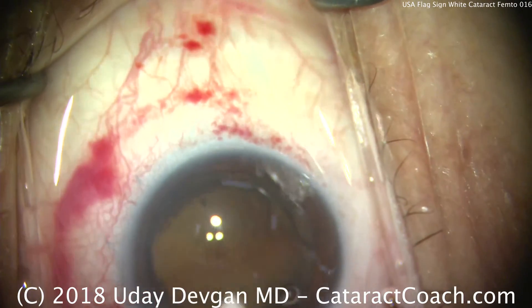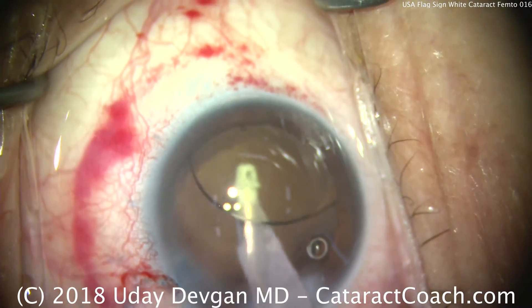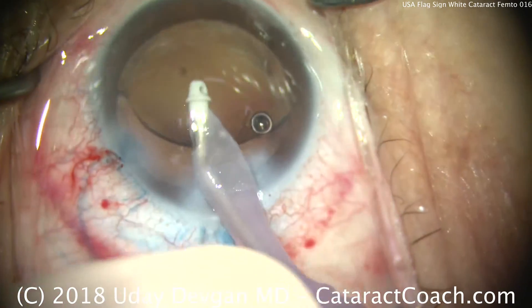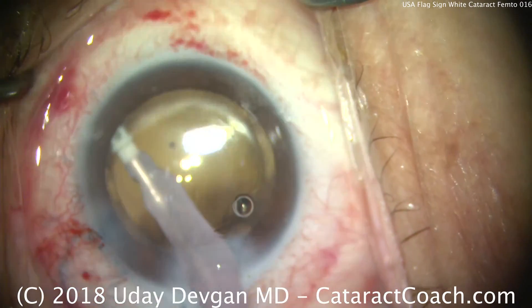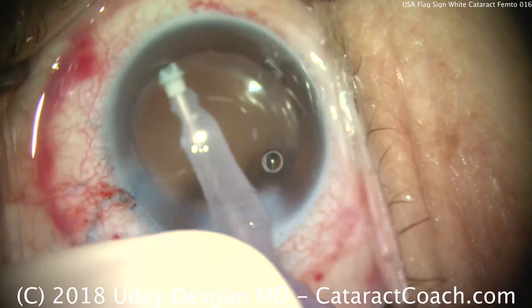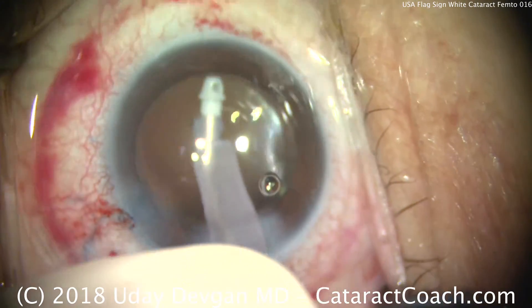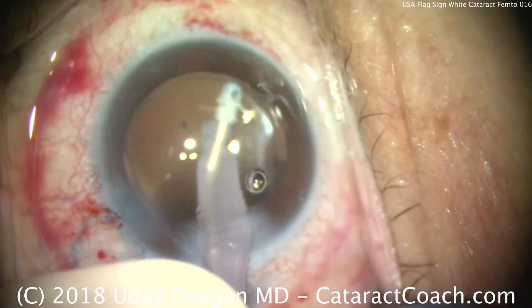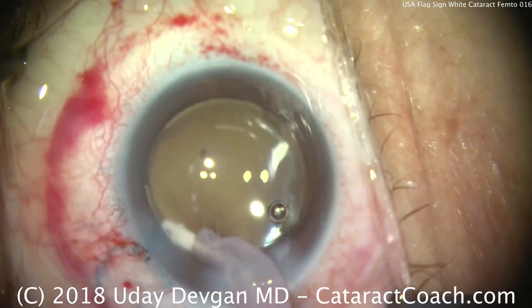We'll go inside the eye and remove the viscoelastic, including from behind the lens as well as from the anterior chamber. This lady has dilated beautifully, so we can see that there's no retained lens material. If you have a white cataract patient with a smaller pupil, make sure you wash and irrigate underneath the iris to ensure no residual cataract pieces are left behind. Cleaning out the angle here as well as the anterior chamber — this is looking pretty good.